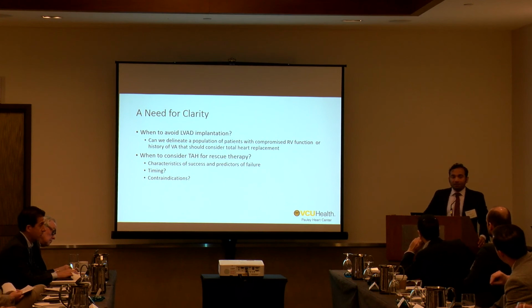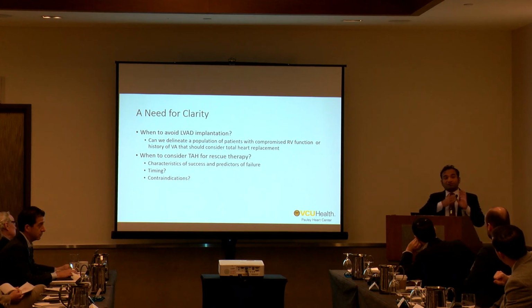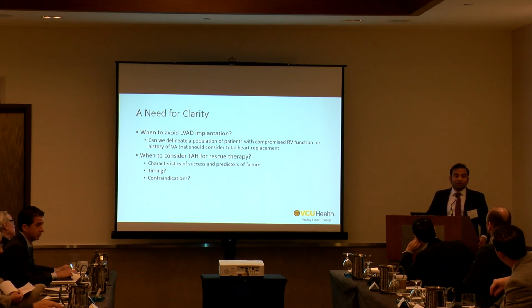So ECMO. In our center analysis, and I think we'll have more information on this, ECMO to TAH to transplant. ECMO has been associated, and I'm not saying not to do it. We've had success getting from TAH off of ECMO to transplant, but ECMO is one of the risk factors for us at our institution for having poorer outcomes post-transplantation. So if you follow the journey all the way out, we do use it, but it is going to be associated with higher rates.